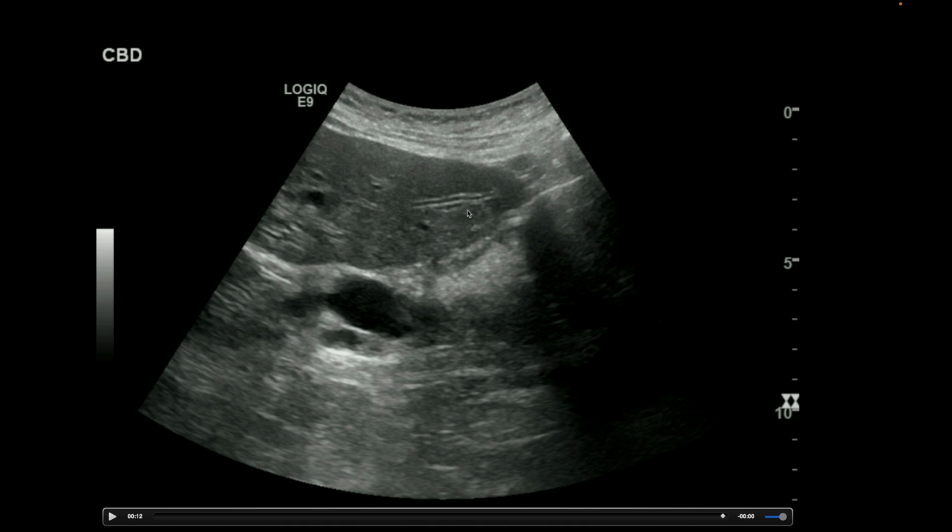To the really clever ones out there, if you look up here in the front of the liver, you can actually see 2 tubes. One of these will be the intrahepatic part of the portal vein, that branch of the portal vein, and the other one will be a bile duct within the liver. Normally you can't see those little bile ducts in the liver, so if they get distended, they blow up and they're about the same size as the branches of the portal vein. So if you can see this double barrel shotgun sign, or some people call it the staghorn sign, within the liver, that's a clue that there's some obstruction to the biliary tree.